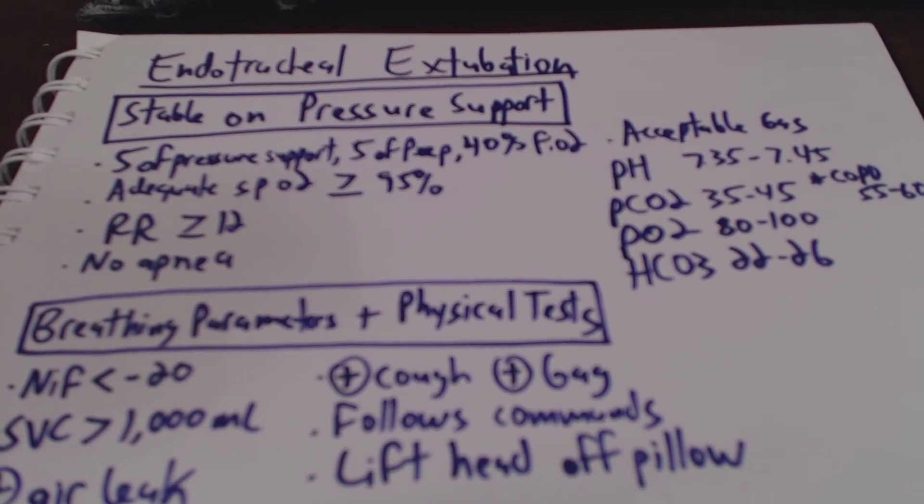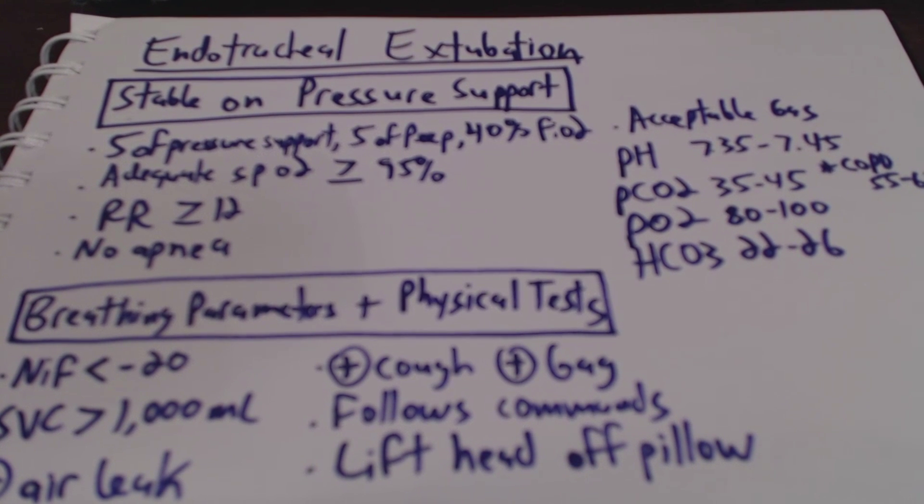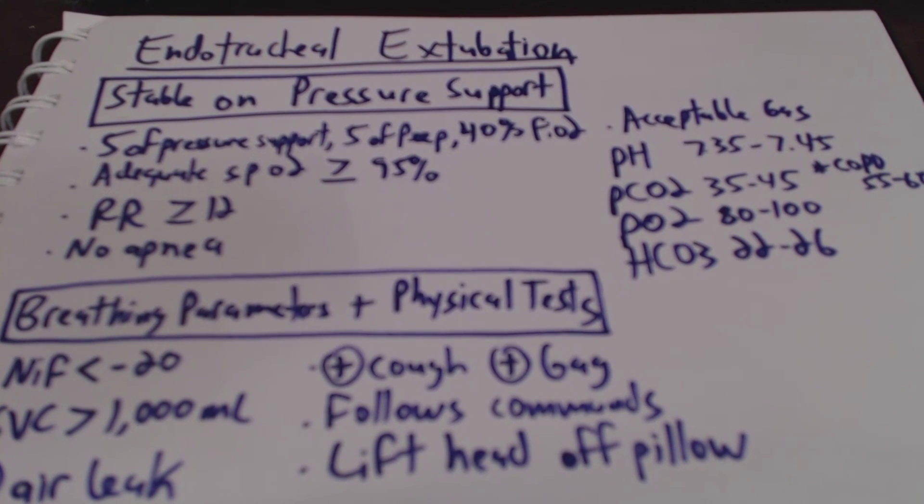Let's get started. Okay, so now we're going to be going over endotracheal extubation and things that we're going to have to do and prepare to make sure that we have a successful one.